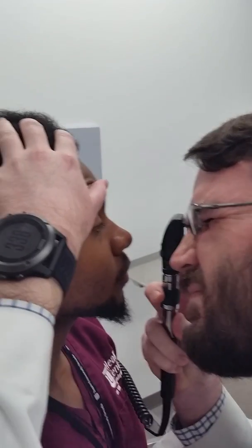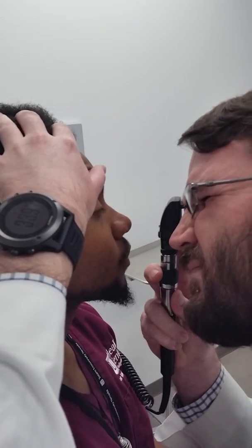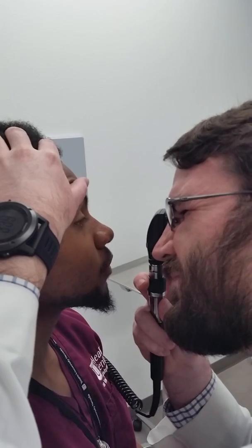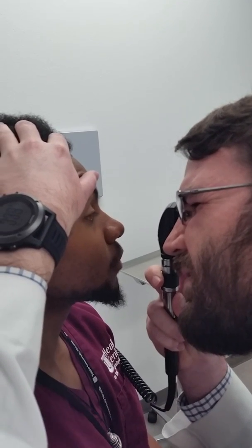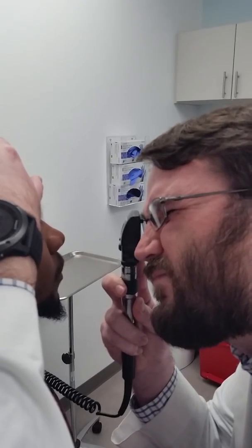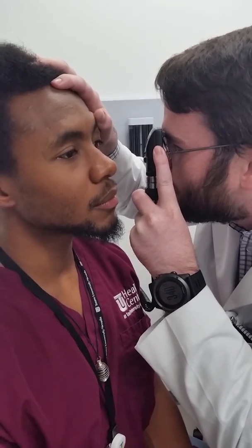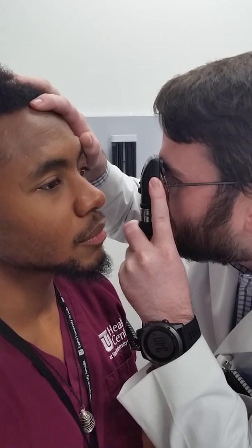He will then adjust his diopter setting either in the positive or negative direction to focus on the structures in the fundus. He will ask the patient to continue looking forward to examine the macula, the optic disc, and then follow each one of the blood vessels from the optic disc out into the four quadrants. Notice how the doctor is subtly making changes in his position to view different parts of the patient's retina. When examining the patient's left eye with his left eye, if the doctor wants to examine the macula, he needs to have the patient look directly at him.